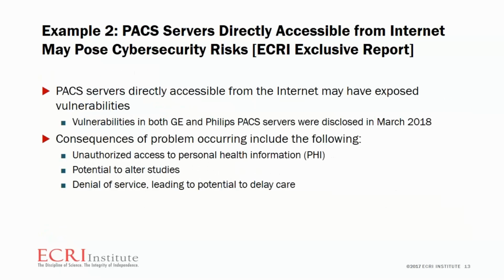The second example was related to, in general, PACS servers directly accessible from the internet that may pose cybersecurity risks. This was derived from research conducted by McAfee, who identified a number of different PACS servers as potentially exposed.